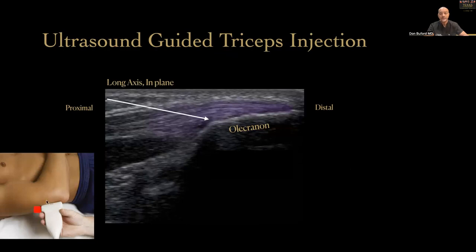Like most solid tendons, it's not going to hold a lot of volume. The rest of your PRP would be outside the tendon, but just adjacent to it.